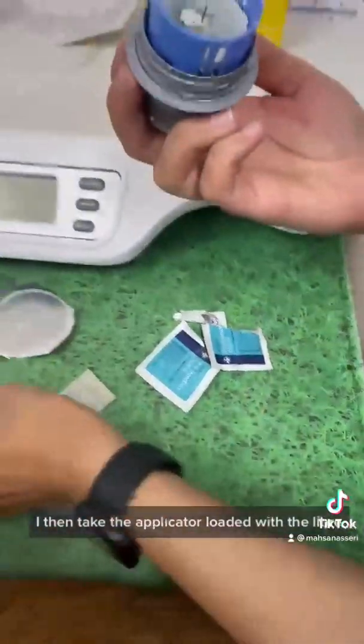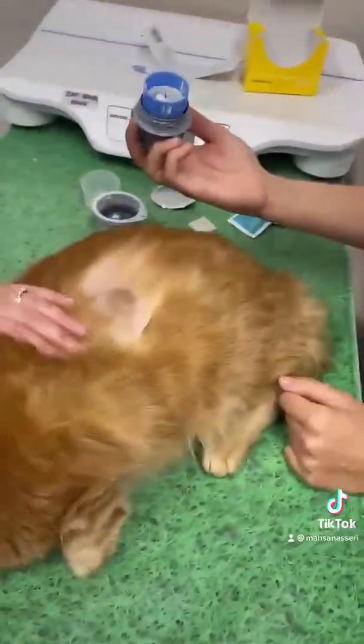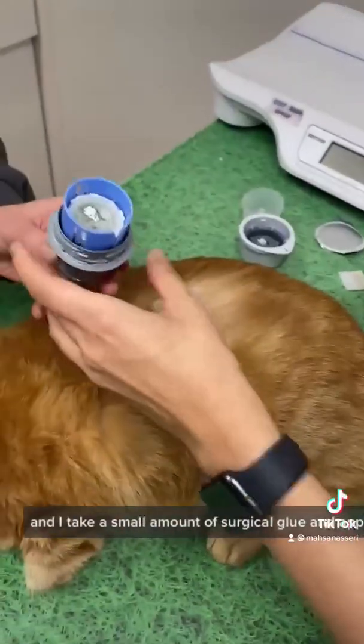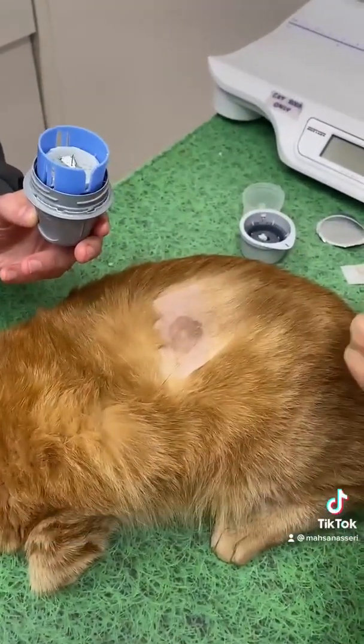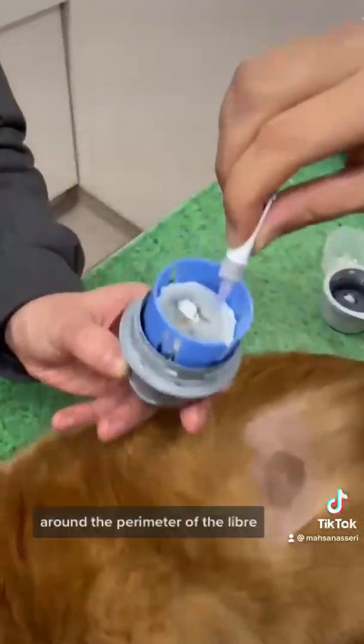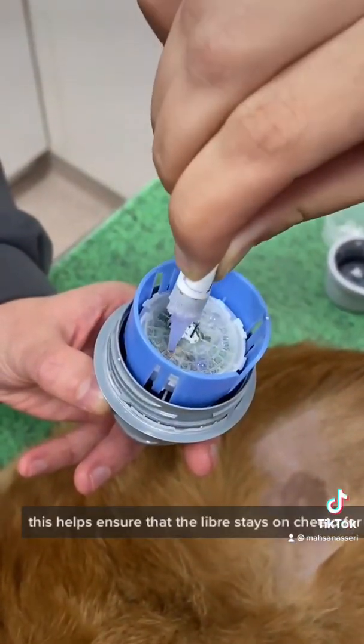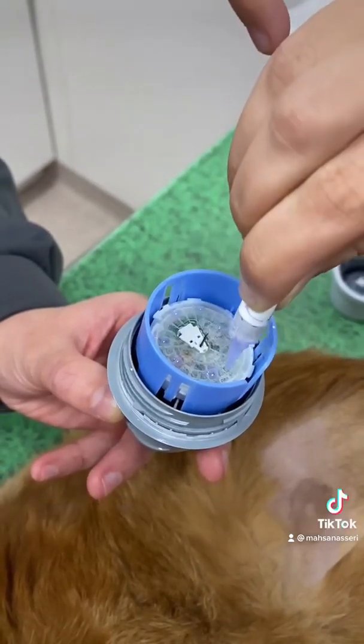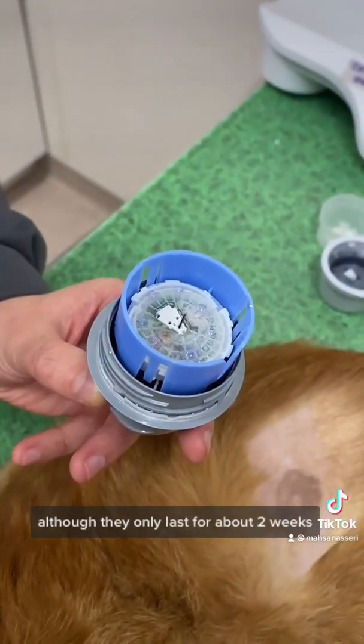I then take the applicator loaded with the Libre, and I take a small amount of surgical glue and apply several dots around the perimeter of the Libre. This helps ensure that the Libre stays on Cheeto for as long as possible, although they only last for about two weeks.